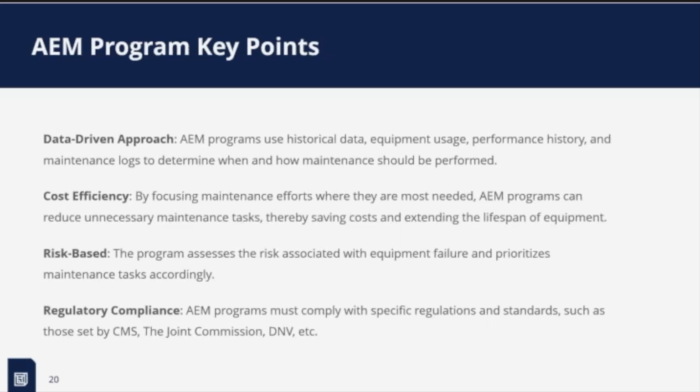We use historical data, equipment usage, failure information, performance history, maintenance logs, everything you document on that equipment. You should use that to build your AEM program. And it's not just a simple AEM program. There's a lot of work that goes into justifying these things.